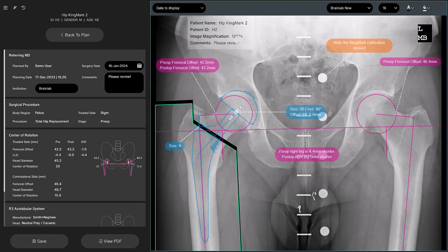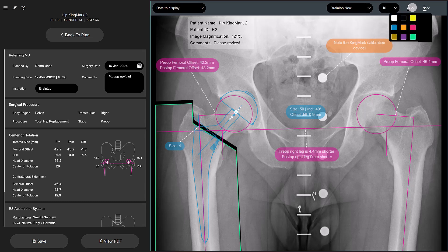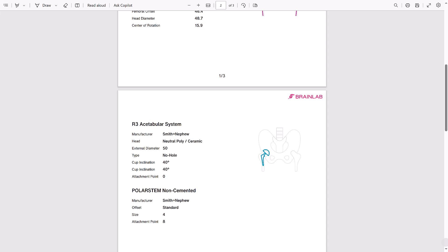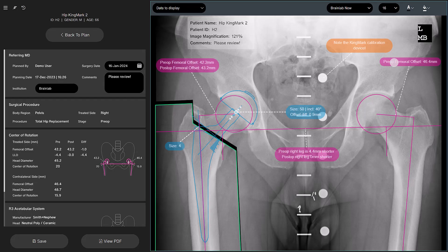You can change the font size, use a different color for the text and background, and adjust the position of the annotation box by moving it to a different location. You have the option to see the report in PDF format by selecting View PDF. You can choose to save the report locally or print the PDF. Lastly, you'll save the case back to Quentry by selecting Save. This marks the end of the TraumaCAD NEO planning procedure for total hip replacement.